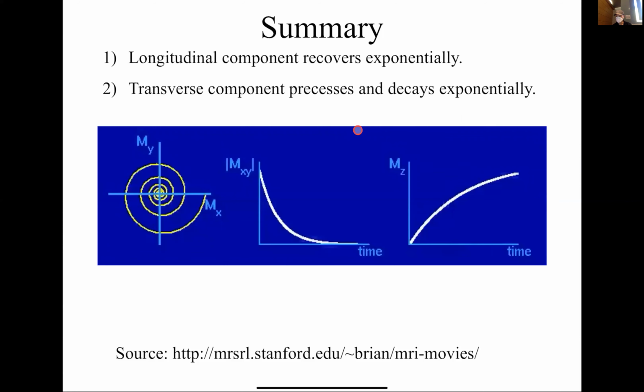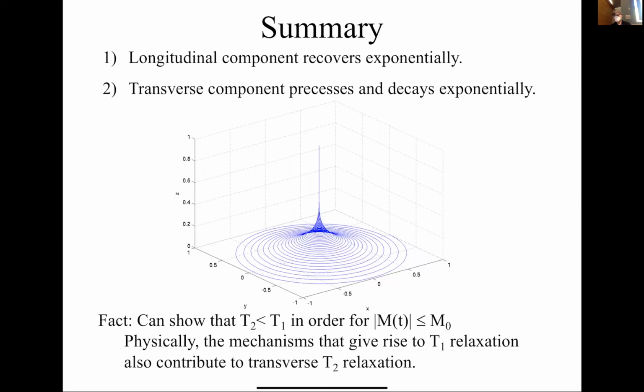Okay, so let me play that one more time. So on this side, you're going to see the transverse component. This is the magnitude of the transverse component, and this is the magnitude of the longitudinal component. Okay, so you see the transverse component dies away pretty quickly here. And then even after it's died away, the longitudinal component can still be regrowing. So that's shown in this picture here.